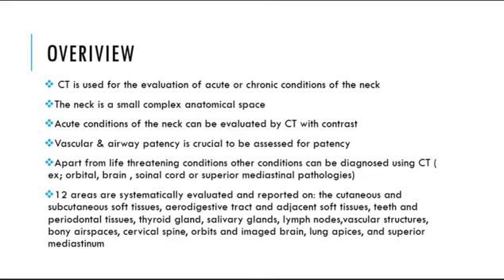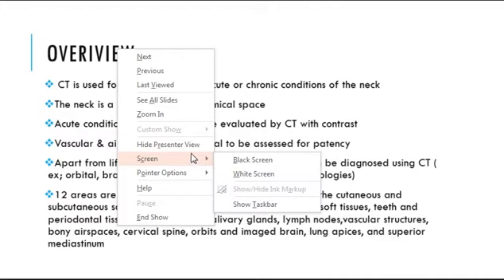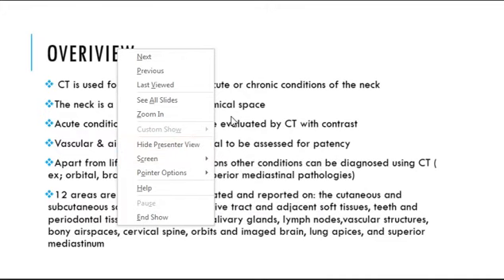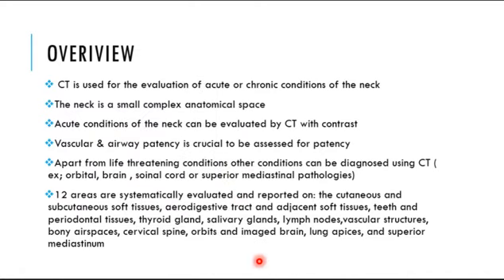Good morning, everyone. Today we are talking about the CT scan of the neck in emergency settings. As we know, the CT scan of the neck is a very commonly used protocol, especially in the emergency settings. So we have to have a specific protocol in order to identify each structure in the neck and each part of the neck. As we know, the neck is a complex area with many structures inside. We have vascular structures, glandular structures, the aerodigestive tract, and the lymph nodes. So we can identify each of these areas separately, so we can synthesize and hypothesize a final CT report which is proper for the emergency settings.